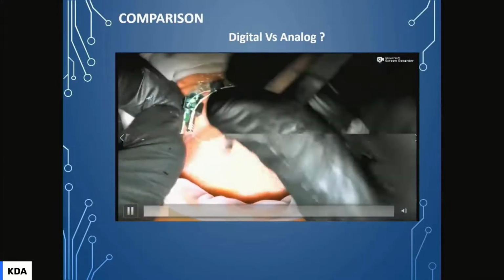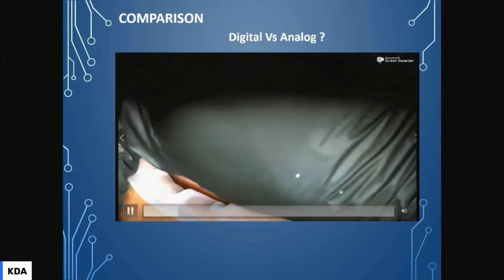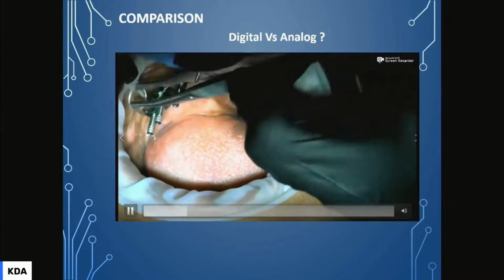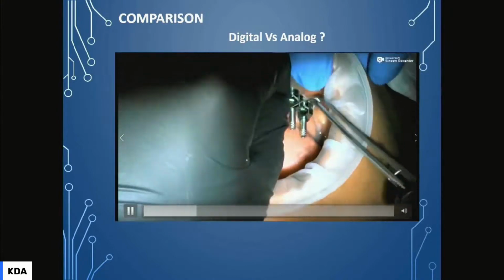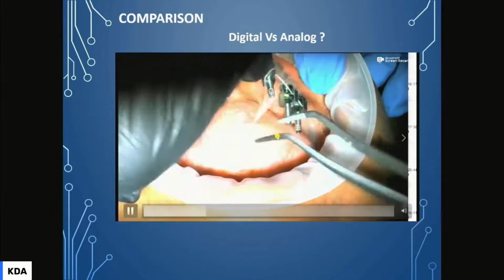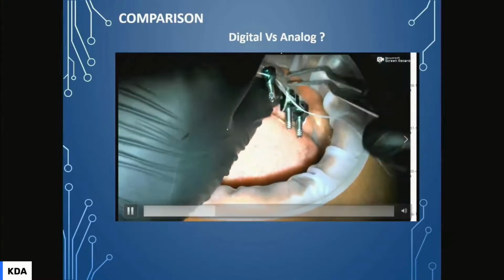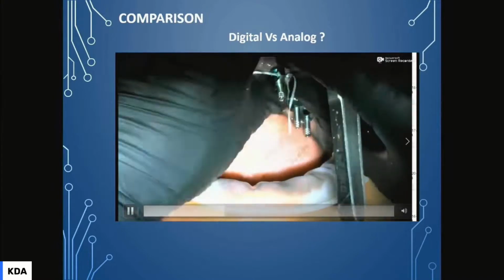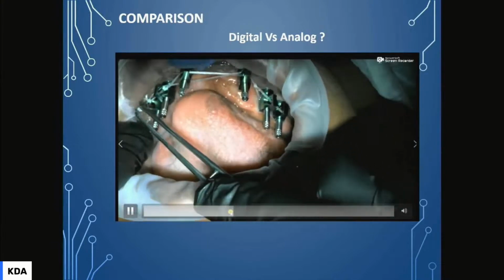It takes minimum an hour and a half just to splint those together, tie up the floss, put our Duralay, and drill holes in our special tray or even stock tray, and then take our impression. It's very tiring, very excruciating for our patients. But we do it for the sake of perfection, for the sake of producing a very accurate impression. We do it, we have to do it. And it takes 2 hours.